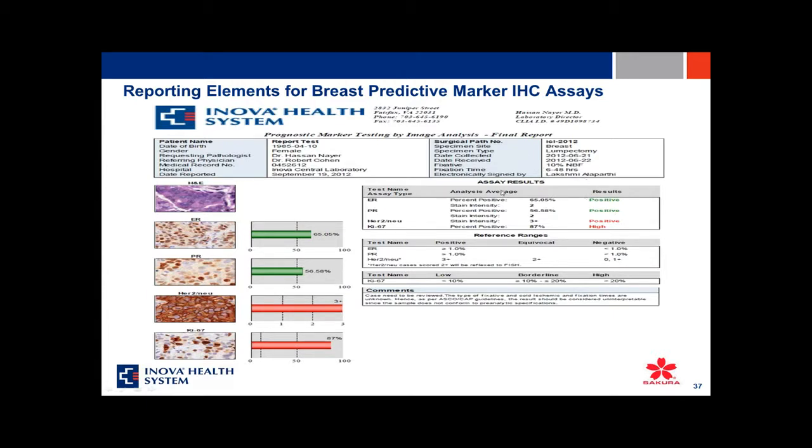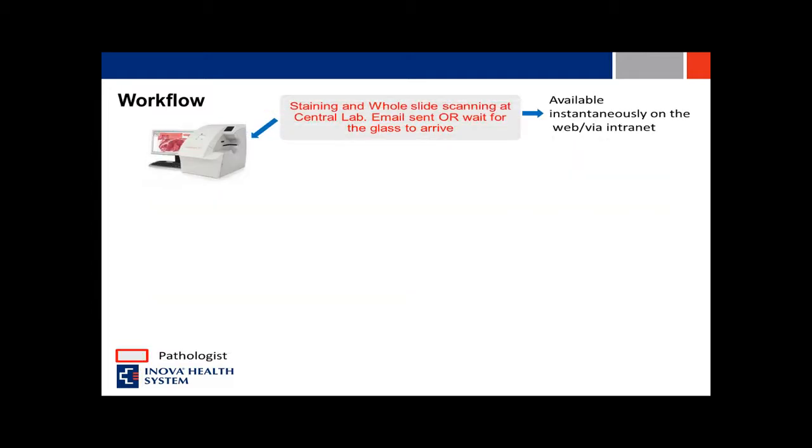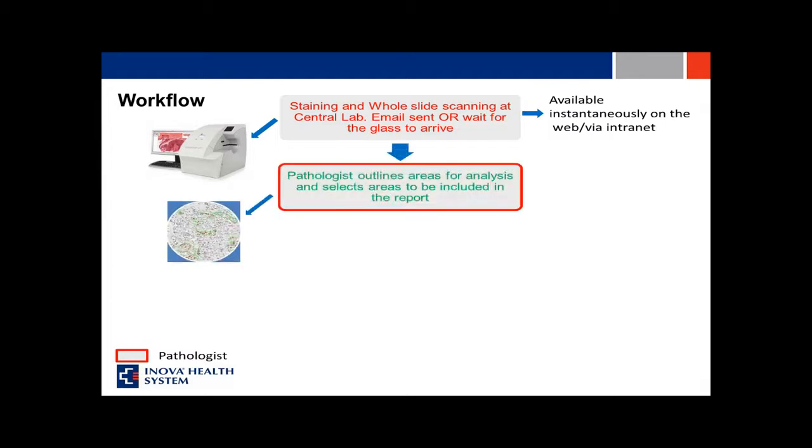And then once the report was generated, the pathologist, whoever signs off on that report. And the second page of this report contains a whole list of disclaimers and the methodology and the techniques that were used and the interpretation guidelines and so forth. And this is our current workflow. We went live on August the 1st with this, and then this is our workflow.